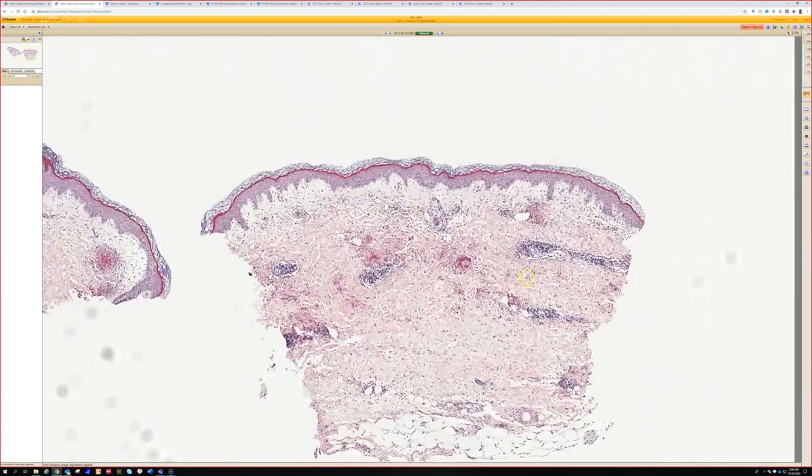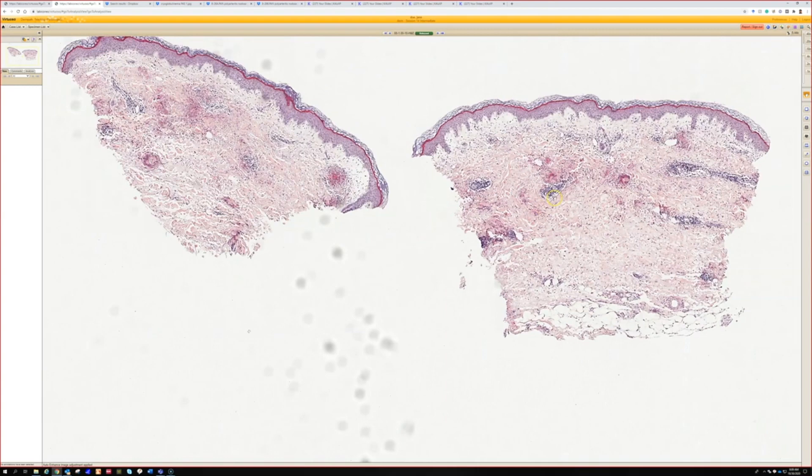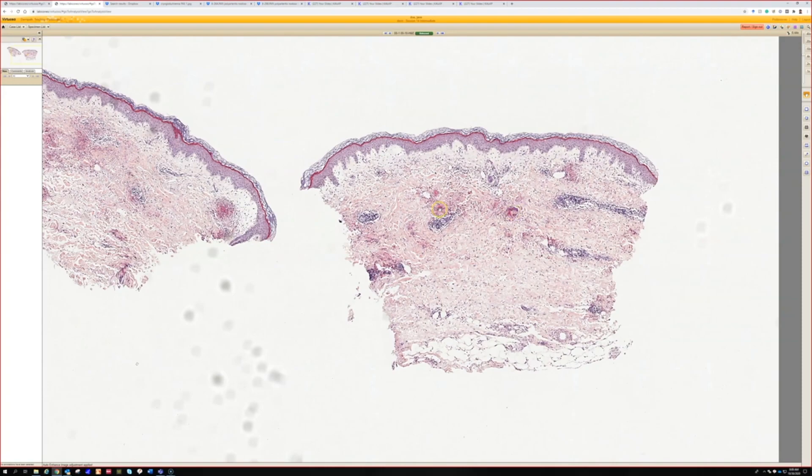I think that's a great differential. The key here, of course, is the flame figure. And even from 0.5x on this scan, you can see them — these bright pink-purple or orange-purple blobs in the dermis. And you can see that the degenerated collagen sometimes seems to almost float in the middle of them.